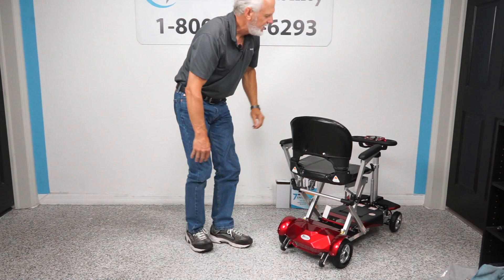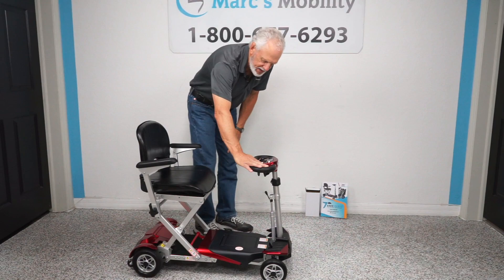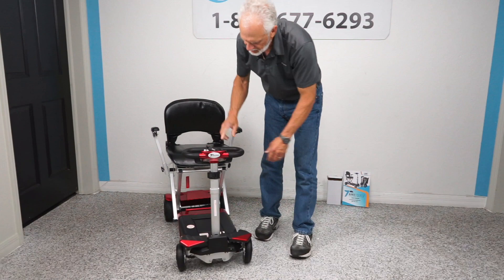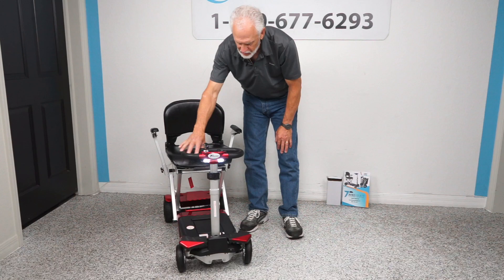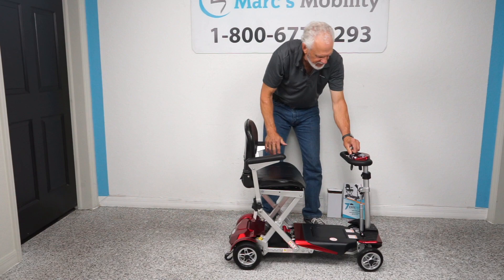The nice thing about this scooter is you can drive it with your right hand forward, or you can use your right hand to go in reverse — so you don't have to have two hands to drive this scooter. You also have a little headlight now. You have a horn, and you also have a speed button on the dashboard that goes from turtle to rabbit, so you can adjust the speed from almost nothing to 3.7 or 3.8 miles an hour.